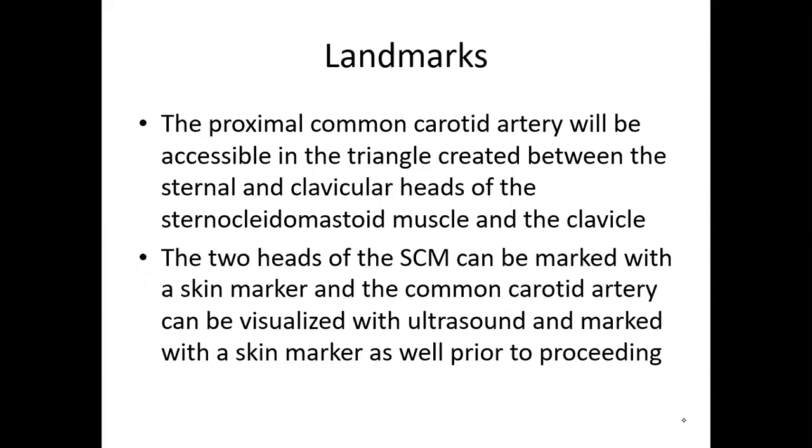Landmarks here are important. So the proximal cervical common carotid artery can be accessed in the triangle that's created between the two heads of the sternocleidomastoid muscle, the sternal head and the clavicular head, and the base of the triangle being the clavicle. Usually I use an ultrasound before I start and mark out that triangle between the two heads with a skin marker, and then mark out where the common carotid is going to be right in the center of it with the ultrasound using a skin marker as well.